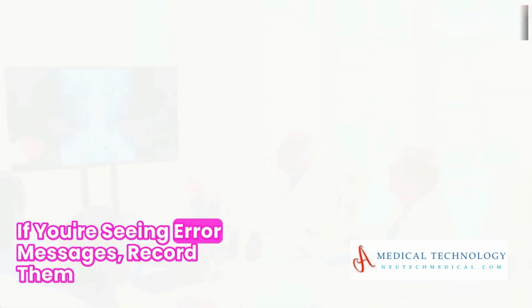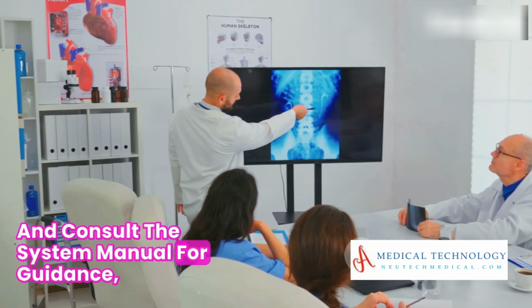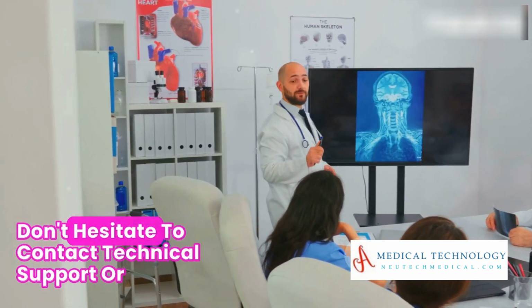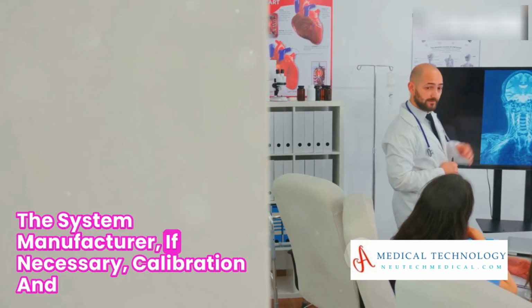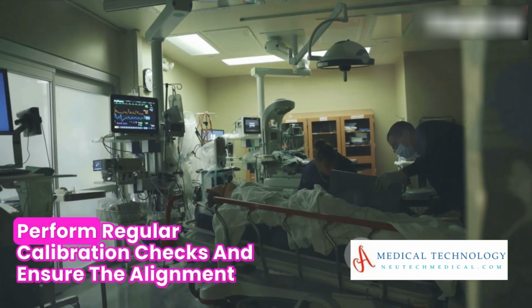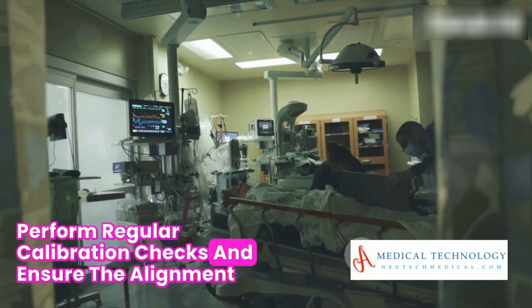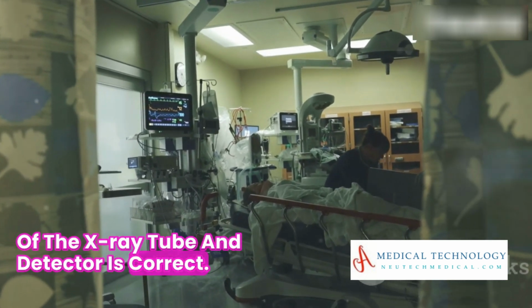If you're seeing error messages, record them and consult the system manual for guidance. Don't hesitate to contact technical support or the system manufacturer if necessary. Calibration and alignment are key for accurate image results. Perform regular calibration checks and ensure the alignment of the X-ray tube and detector is correct.